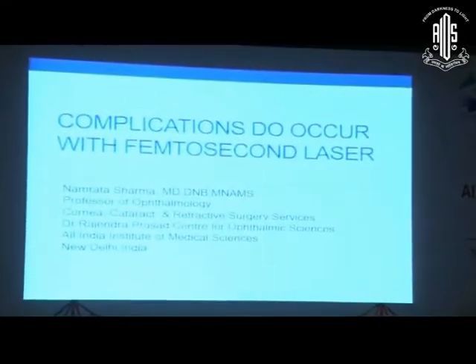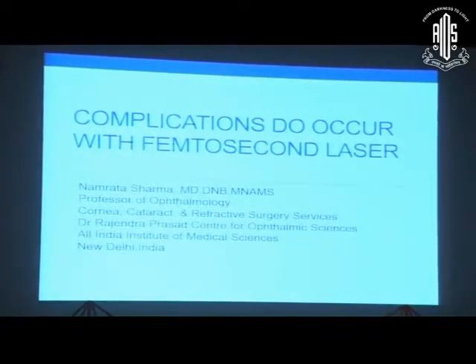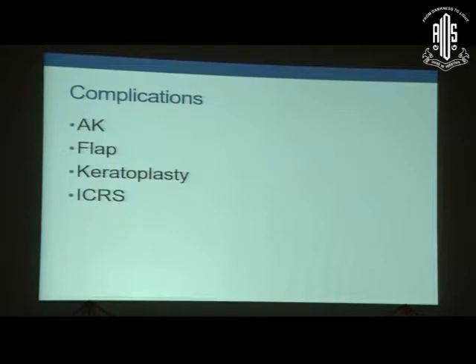So even though we are using femtosecond laser for so many applications and trying to replace the manual technique or the microkeratome with the femtosecond laser, complications do occur with femtosecond laser which are unique to femtosecond laser, and also some of them which are flap related or cap related, which would still occur when we do these techniques with the conventional method.